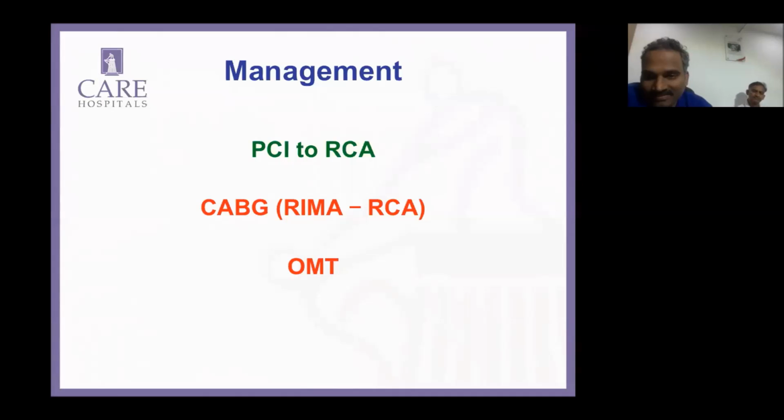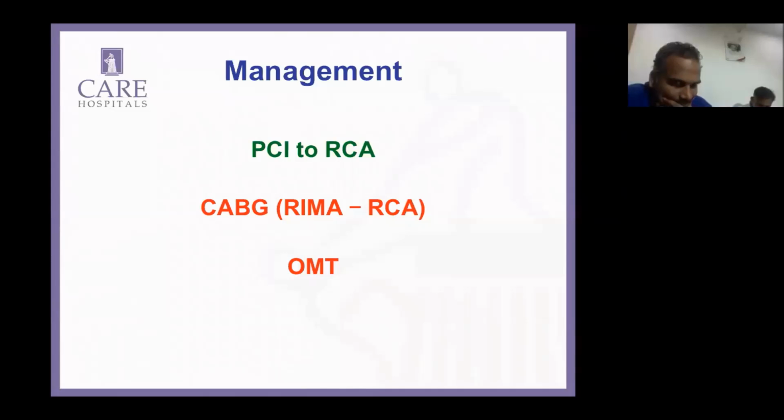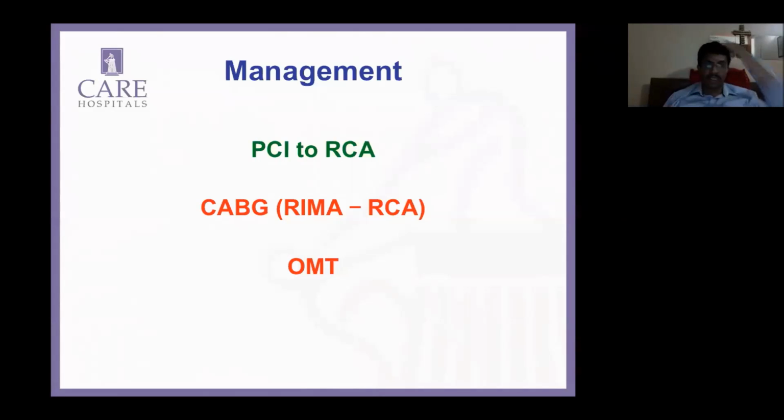Yes, the resolution of the conventional angio is obviously limited, and by using techniques like IVUS, we're really beginning to see a lot of things that we were not used to seeing before. Yes, especially when it comes to stent implantation and other things, like tissue prolapse. Plaque morphology and tissue characteristics are obviously much better with IVUS. And now the recommendation has become very clear that you don't do a left main intervention till you have an IVUS with you. It's become almost as clear as that.